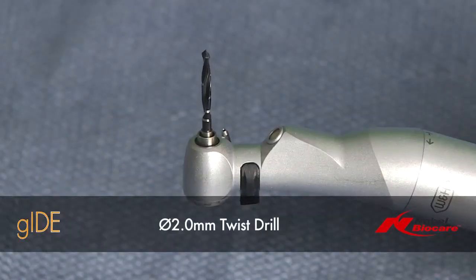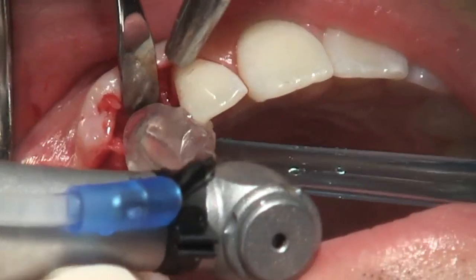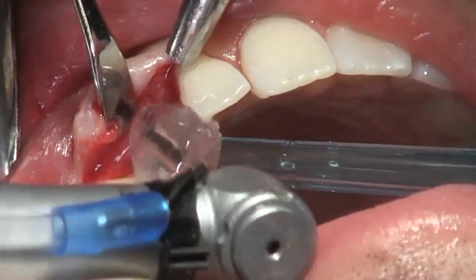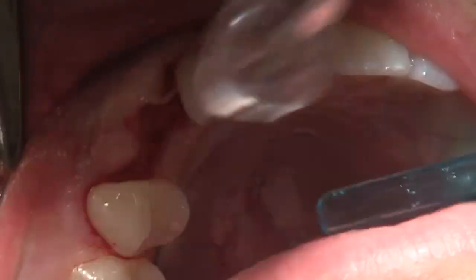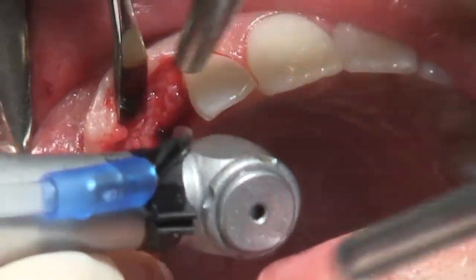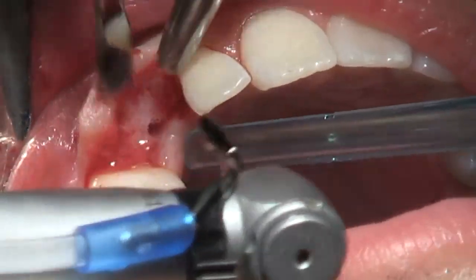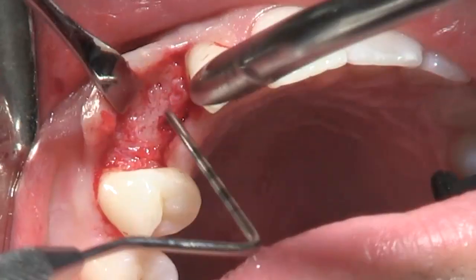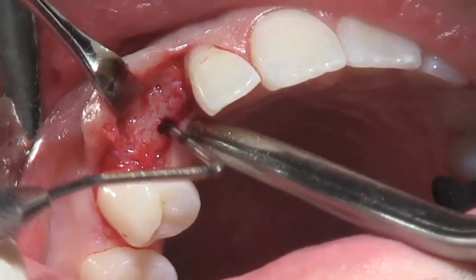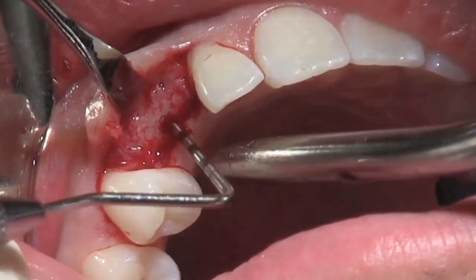The next drill is the 2 mm twist drill with external irrigation, still using the surgical guide stent for its optimal position. Then the surgical guide is removed and good access is allowed to continue with the osteotomy. An implant probe is being used to detect any perforations, and indeed in the buccal apical area, in the narrow part of the bone, a small perforation is noted.